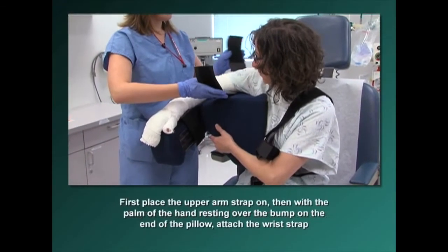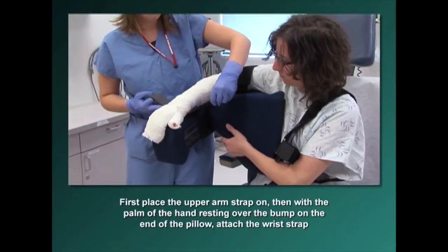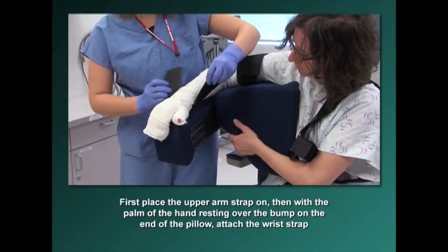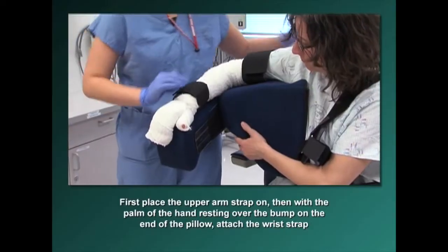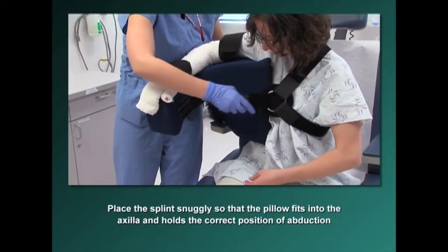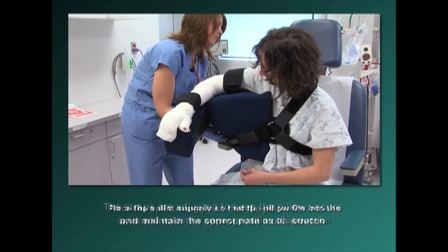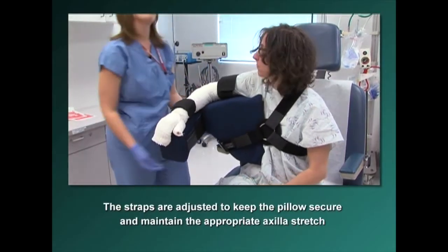First, place the upper arm strap on. Then, with the palm of the hand resting over the bump on the end of the pillow, attach the wrist strap. Place the splint snugly so that the pillow fits into the axilla and holds the correct position of abduction. The straps are then adjusted to keep the pillow secure and maintain the appropriate axilla stretch.